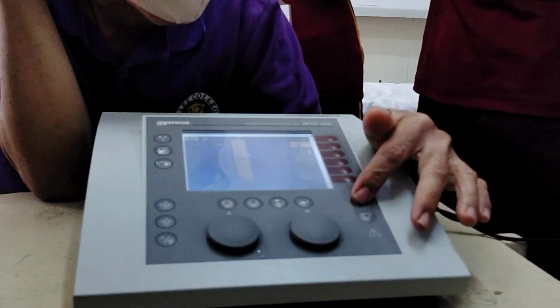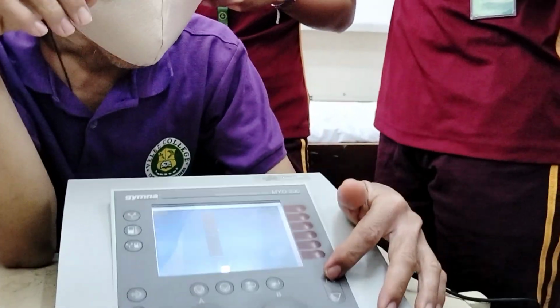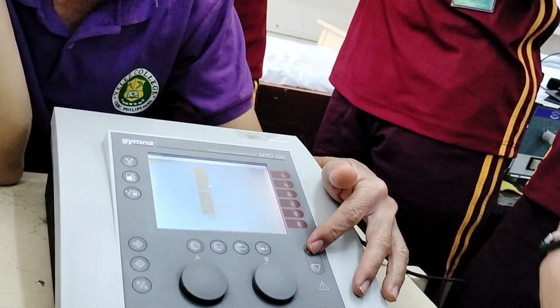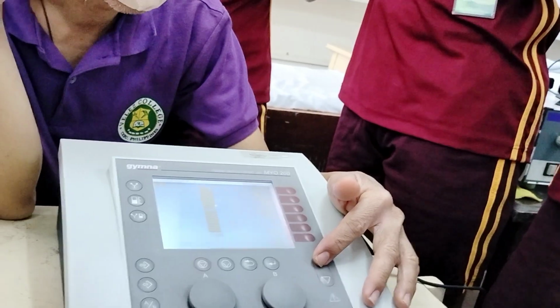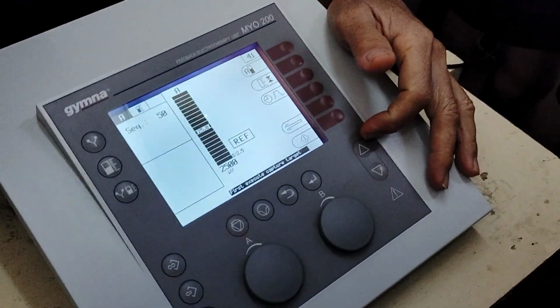P stands for pressure. With pressure, it will not get the motor unit action potential but pressure instead. But it is still biofeedback. So, what are examples where we can apply this pressure?